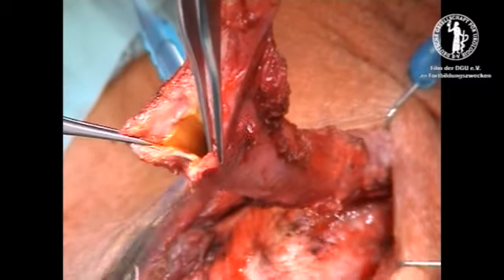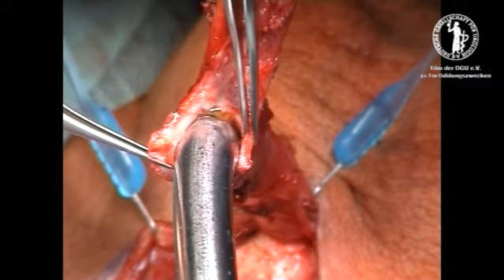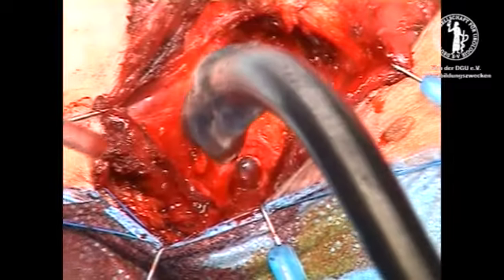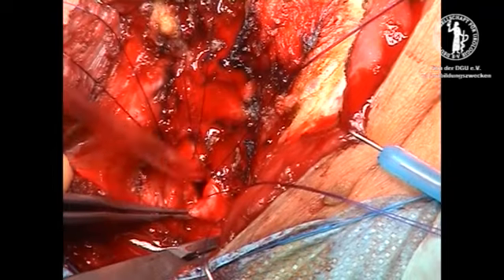The urethra is spatulated on both sides to get a wide open anastomosis, calibrating both ends by a 30 French bougie. The anastomotic repair is done with 6-0 Monocryl.